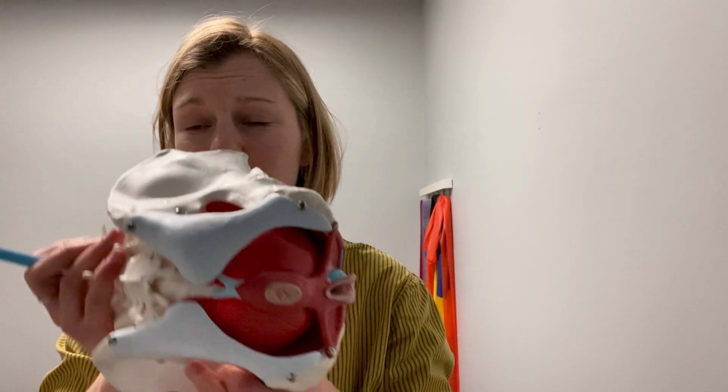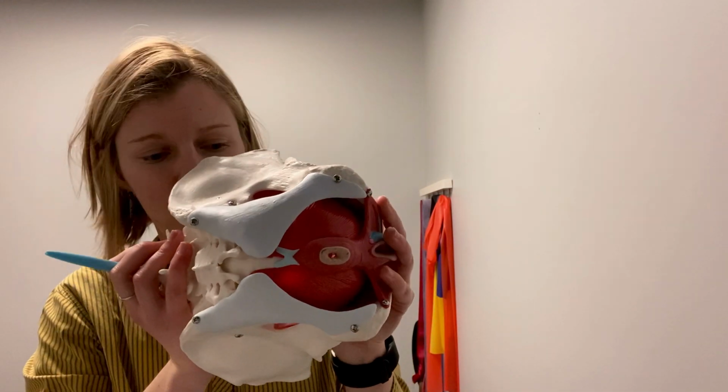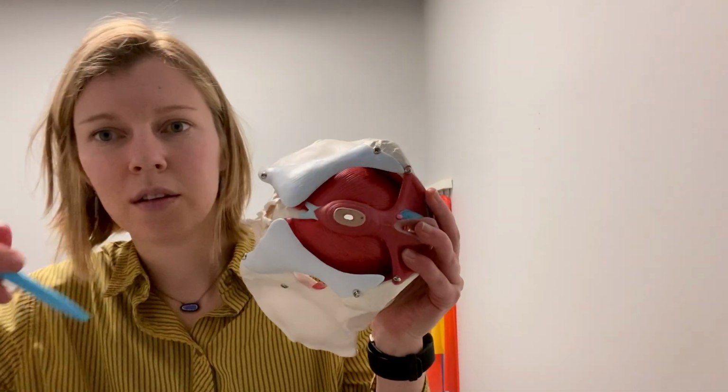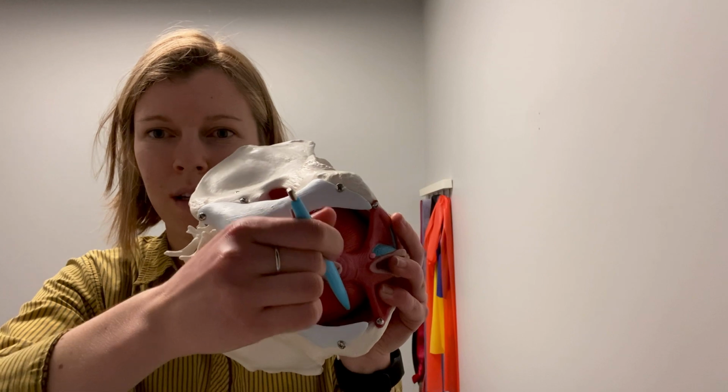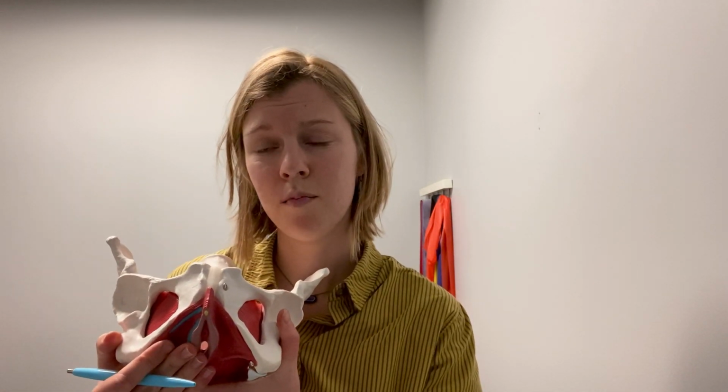Another muscle we can hit, a really fun one, is called the obturator internus muscle. And this is also lying on your side. Our needle is often coming down this way into the pelvic floor. All of these have amazing benefit for a tight or hypertonic pelvic floor. And while this is a female anatomy model, we also do this on male pelvic patients.